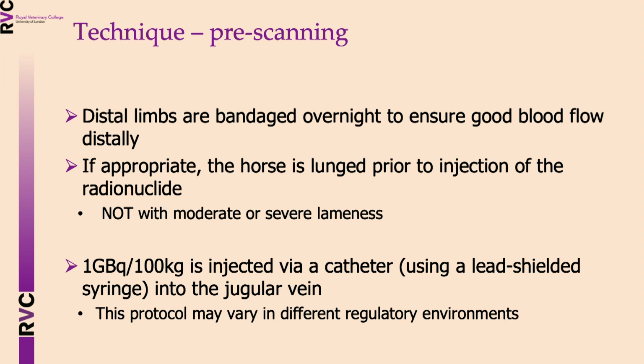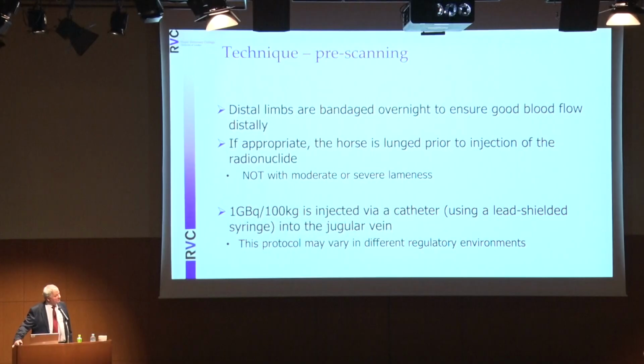Because that can be the reason why the horse is being bone scanned in the first place.